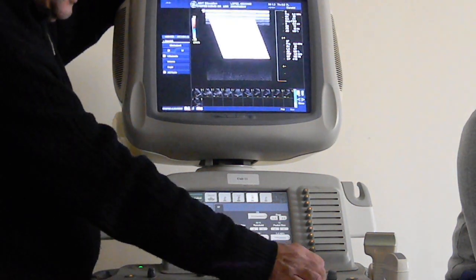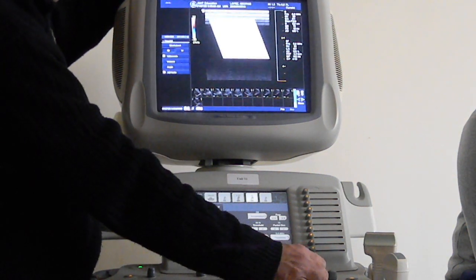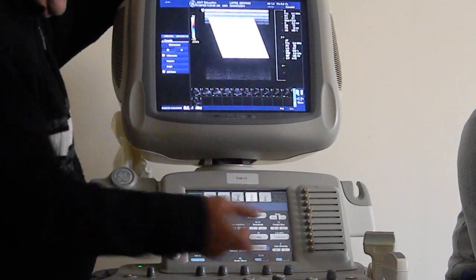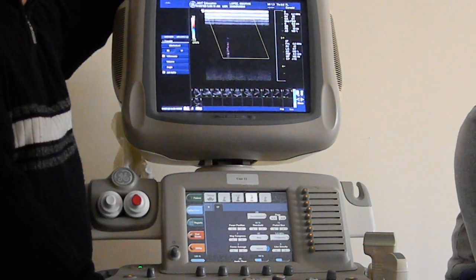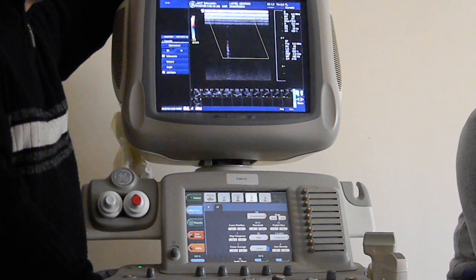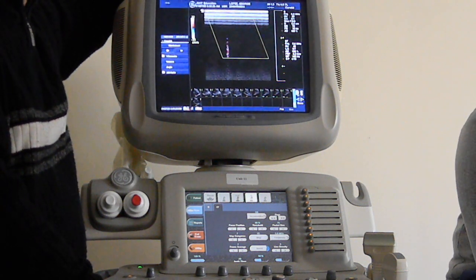So how did I get that? By turning your knob here clockwise. If you see something like this, how do you get rid of it? Just go anti-clockwise. Did that make sense? Any questions? Anybody have anything to say? Any words of wisdom? Good.